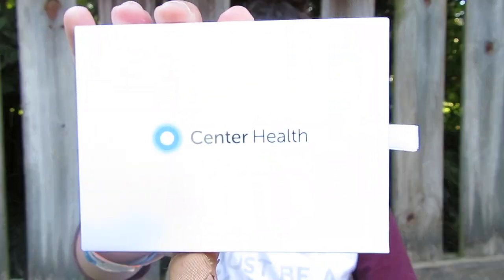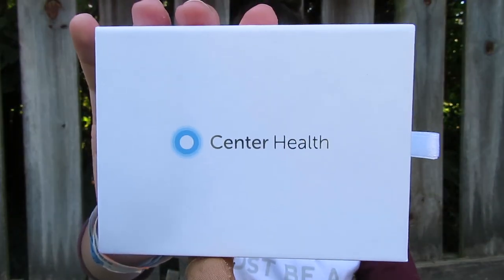I signed up for the unlimited one because my mom was like, 'If you like it, we can start using that.' So that's what I did. Here is the box — it's really bright out so it's probably hard to see, but it just says Center Health. I actually really like this box; I'm a weird person but I really like boxes.